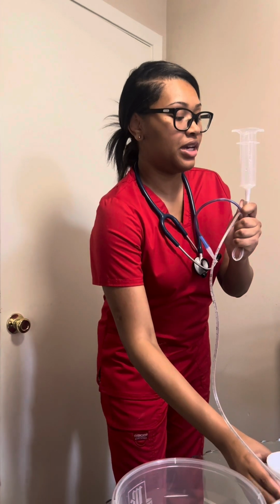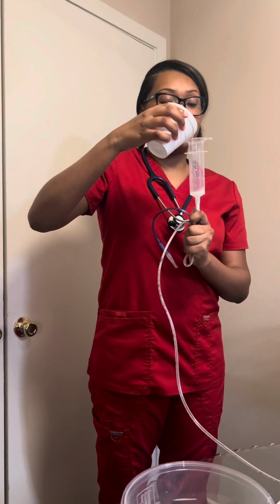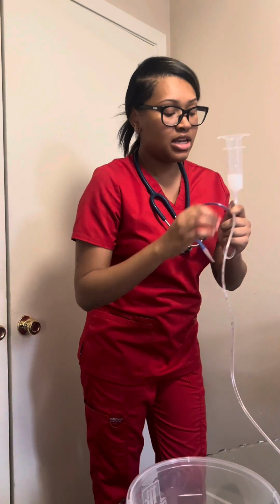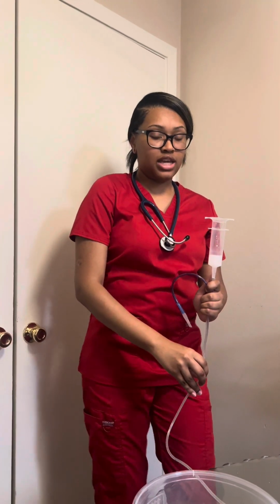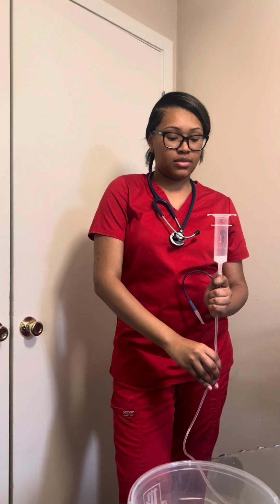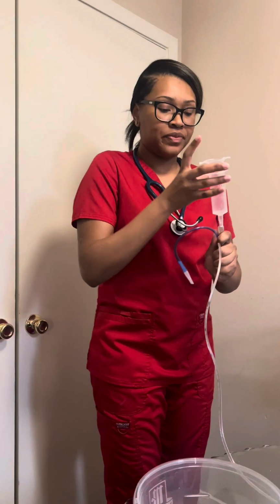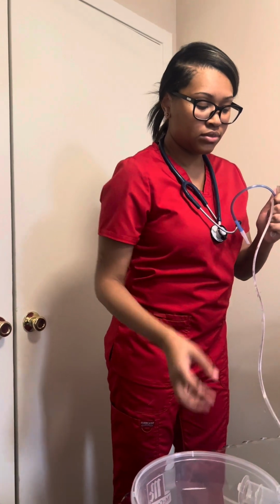And then I will put 20 to 30 milliliters of water to make sure that it does not stick to the sides of the tube, as well as make sure that the patient gets all of their medicine. Okay, clamp that, and then we'll take this off.